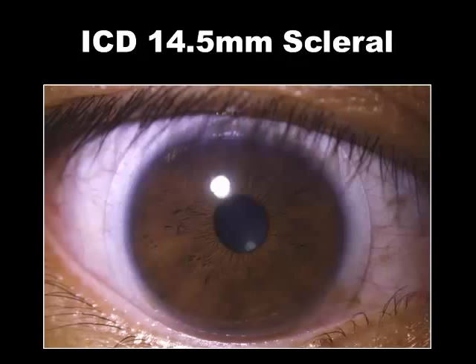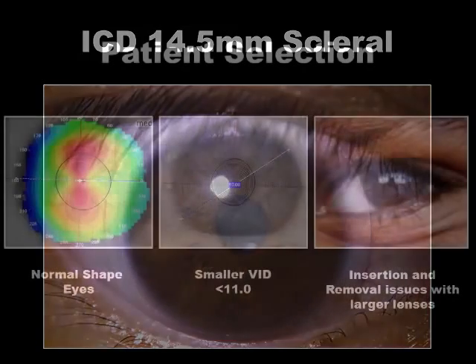And that led to the construction of a 14.5 millimeter version of the ICD. This lens is basically a cut-down version of the ICD. All the zones are the same. All the thought processes and fitting methods are identical.